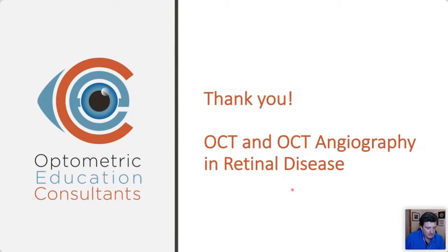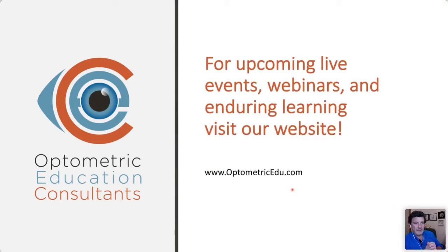And then there was about 25% that maybe this is something you'll put into your practice, or maybe you don't have to because it's just not your practice modality. But when you get the OCTs and you hear people talk about them or review them, you'll have a better understanding of how to interpret them. So that ends the CE program.